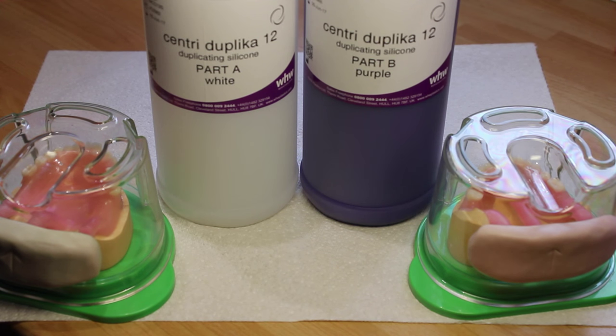The next stage is to pour the silicone into the flasks. Here I'm using Centri Duplika 12 from WHW. Note that if you are using agar, you wouldn't have pour channels onto the dentures — you would cut those manually later — but the agar will need to be a very strong one that reproduces detail very well.